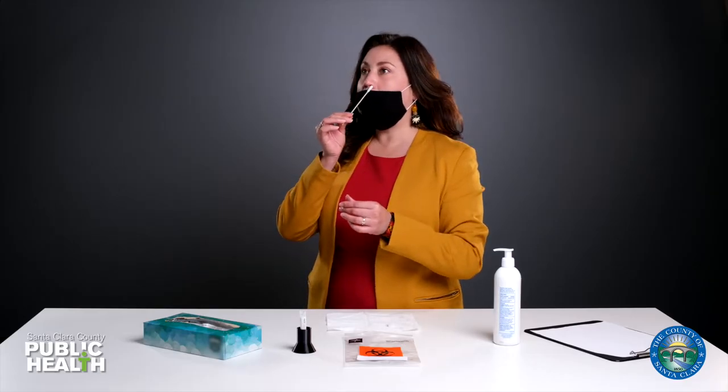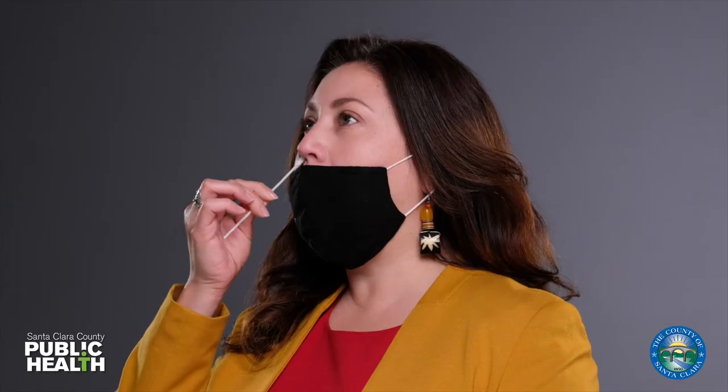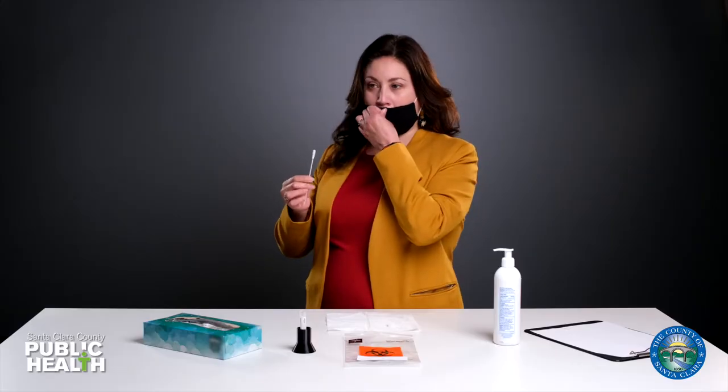Put the swab in one nostril and swirl it firmly around 10 times. Do the same for the other side. Cover your nose with your mask again.